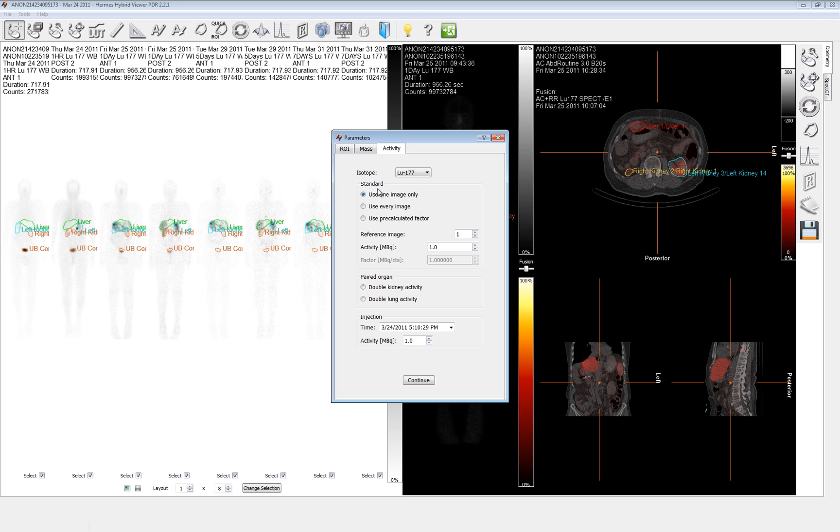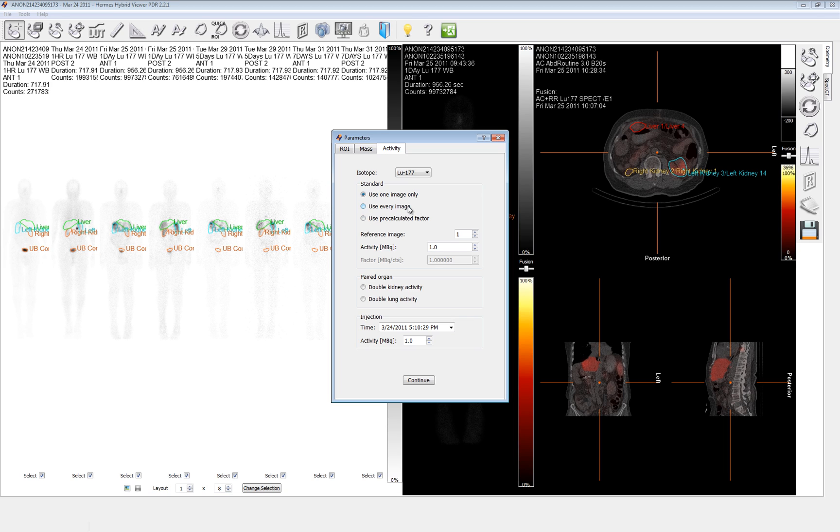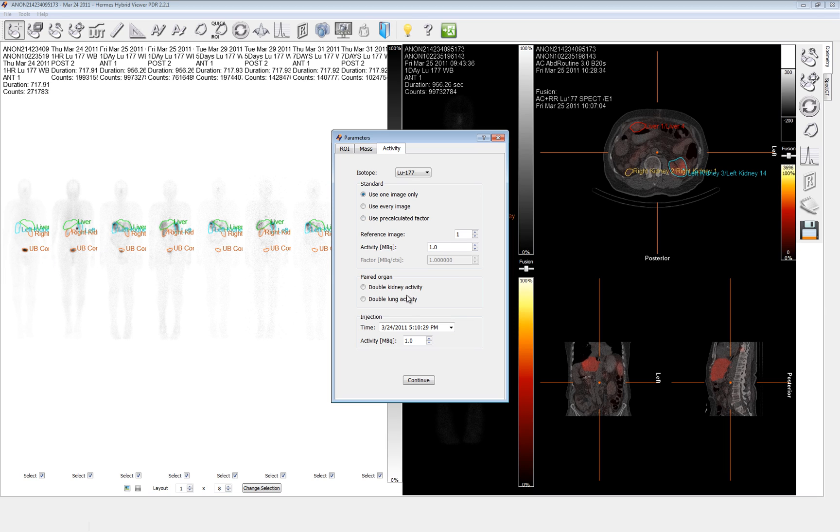The next few choices are about how to use the standard. Since we haven't actually chosen any of the standard images, it's going to eventually go down to use pre-calculated factor and scale all of these to counts per second being the same efficiency. So you'll want to use a standard in every image if you can't manage to use the same camera each time. You could use one image only if you really wanted to scale that to a known factor. But as what we're trying to get here is residence time or the assumption that everything goes back to the full amount injected, the pre-calculated factor is sufficient if the patient had not voided before the first image.